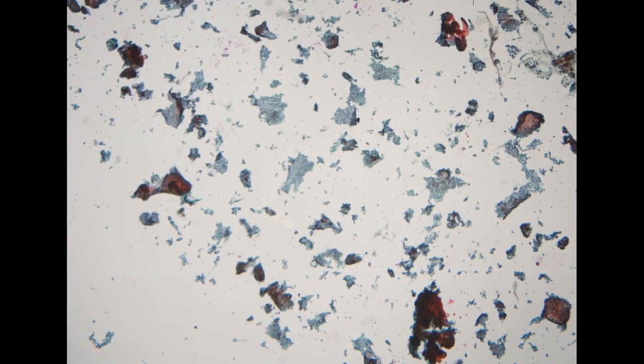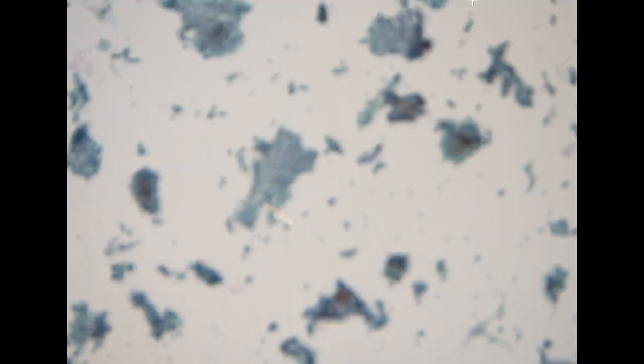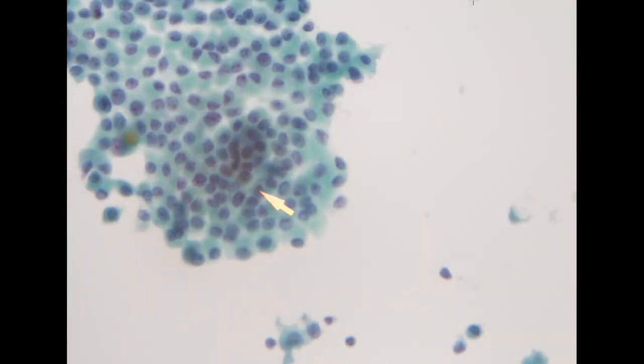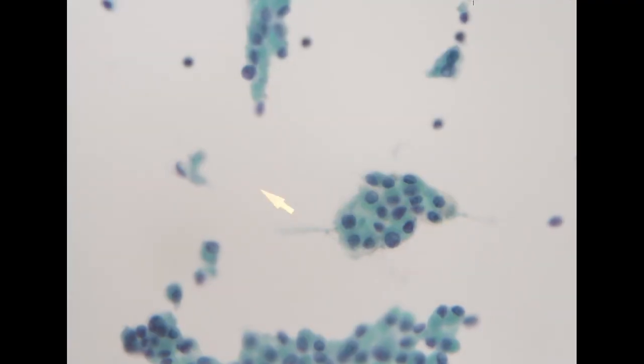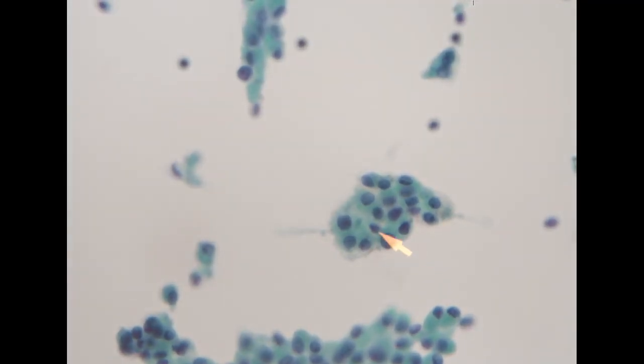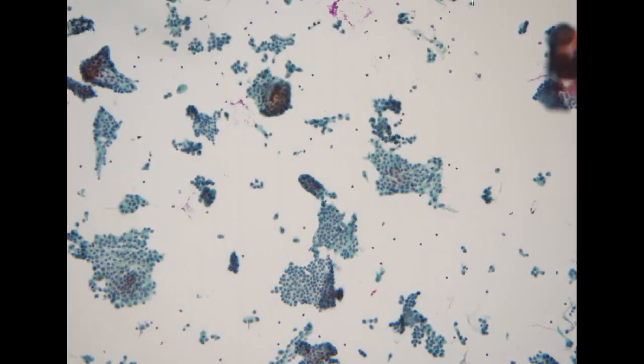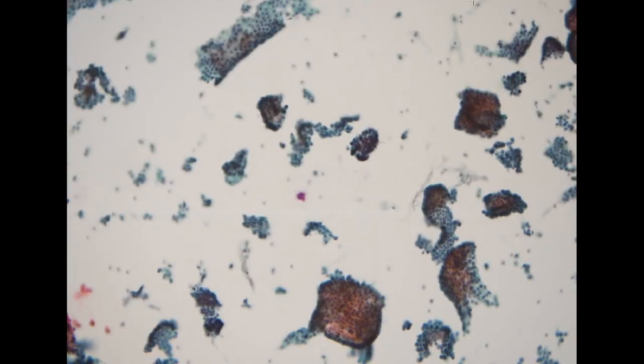When we suspect papillary thyroid carcinoma, we usually go to these more flattened sheets where it's easier to find the pseudoinclusion. So here we do see a pseudoinclusion over here. So this is compatible with papillary thyroid carcinoma.